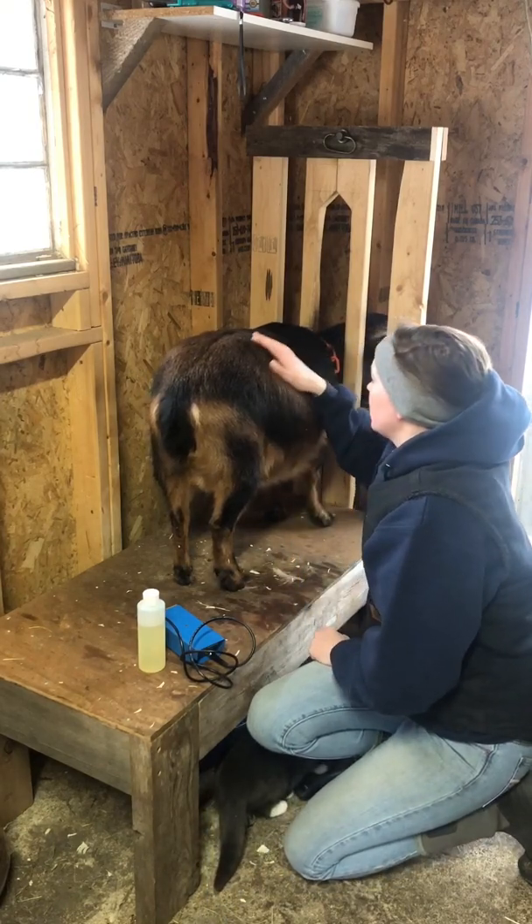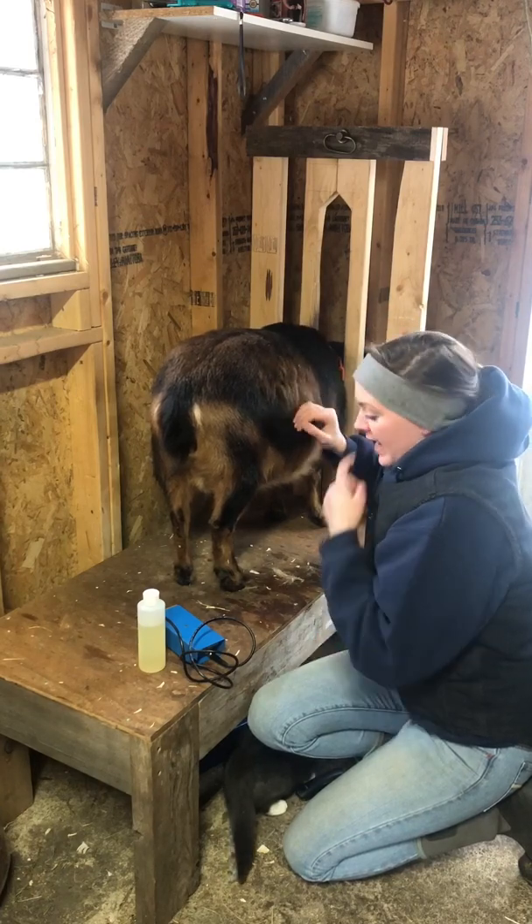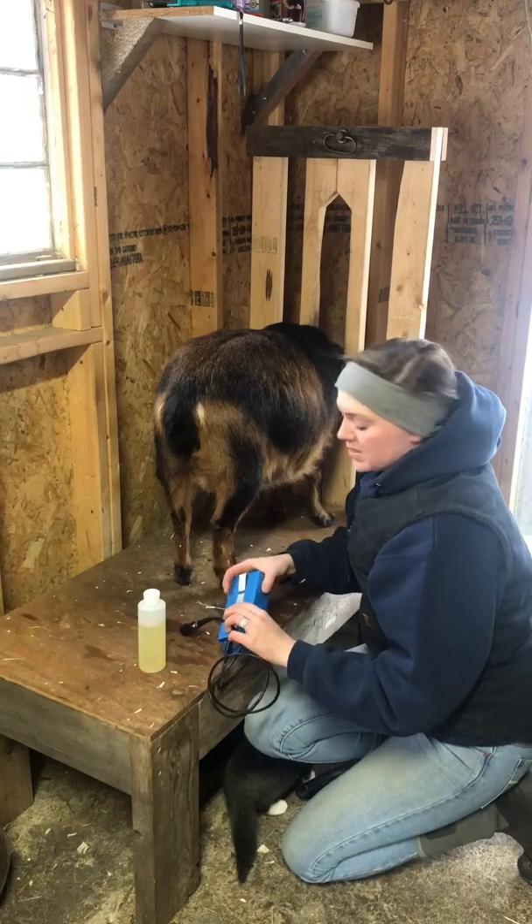You definitely want to shave it down to bare skin. That will allow you to have direct contact with her skin and give you the best results.